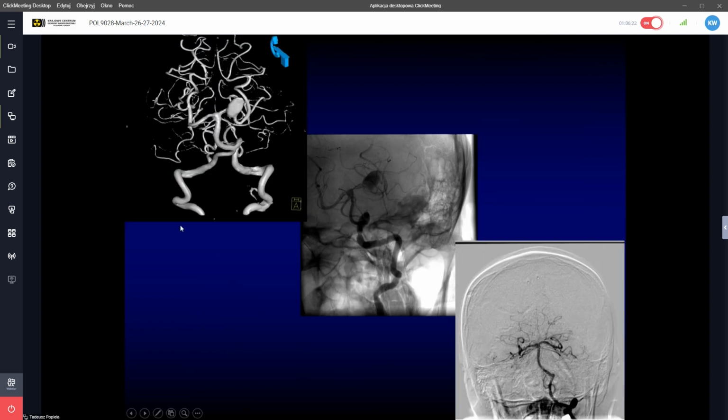And here is a case with an aneurysm on one of the posterior cerebral arteries on the left side, and it's really not a saccular one. I think it's quite a mix of saccular and fusiform. So it means that the part of the artery is enlarged in all directions. So there is no way for neurosurgeons to put a clip. There is no way for us to put just coils, because then we will make embolization of the posterior cerebral artery, which is not the deal.